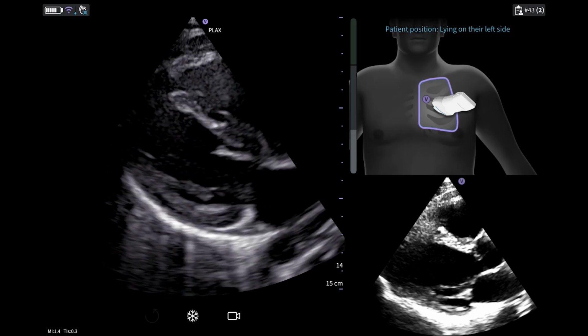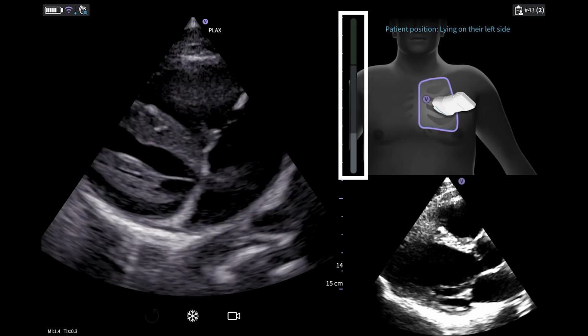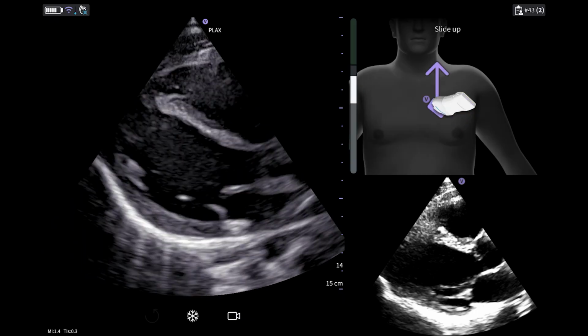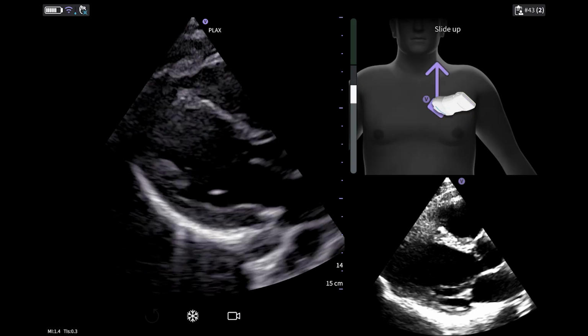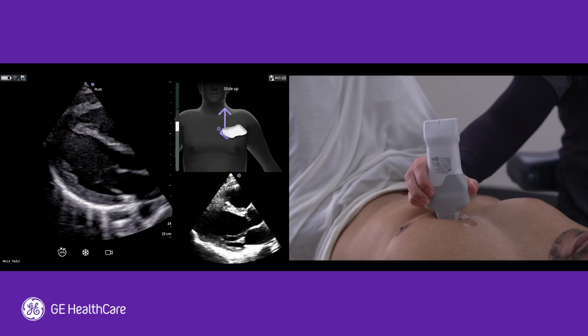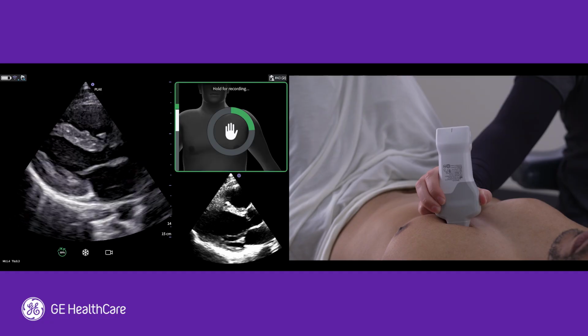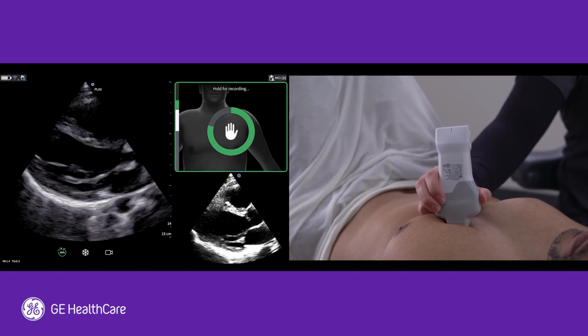As you perform the guidance movements, the quality meter will rise or fall as you get closer or further from a diagnostic quality image. When scanning, make sure you are making movements slowly, giving the quality meter time to respond. Good practice is that once the meter changes to white, stop and stabilize your wrist, as you will likely only need to make small movements from here.